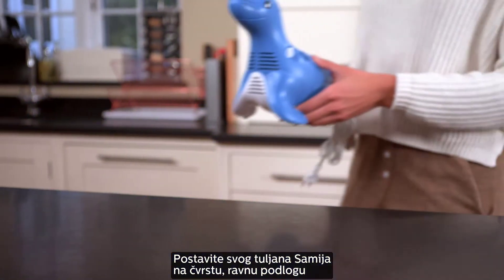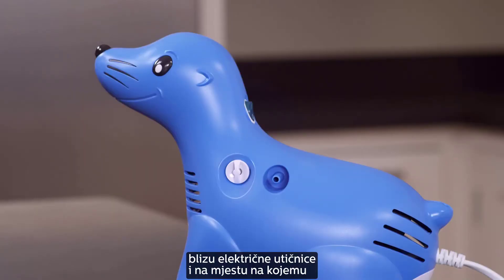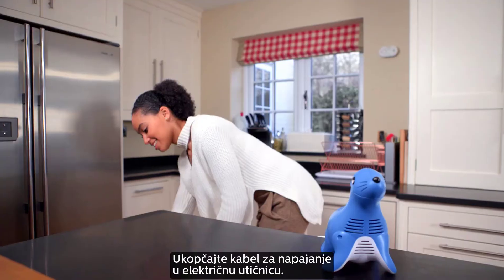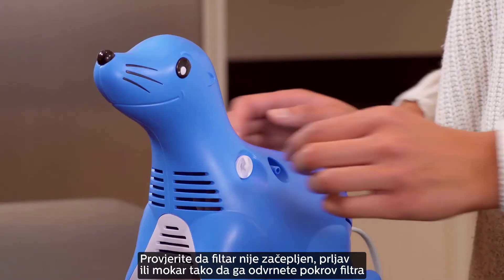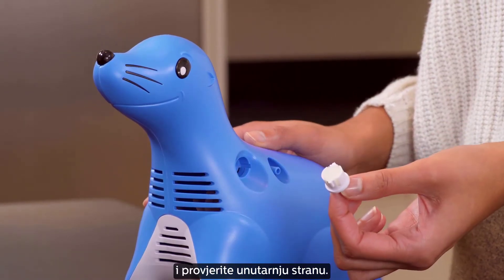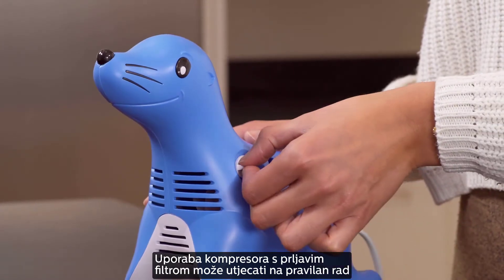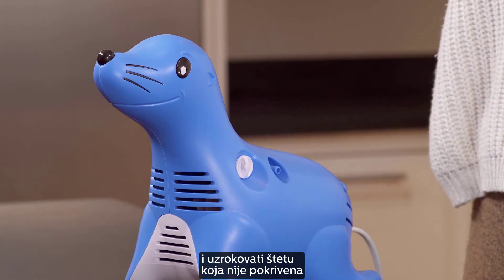Place your Sammy the Seal unit on a firm, flat surface near an electrical outlet and in an area where your child can be seated comfortably during their treatment. Plug the power cord into the electrical outlet. Check that the filter is not clogged, dirty, or wet by unscrewing the filter cover and inspecting the filter inside. Operating the unit with a dirty filter can impair proper operation and cause damage that is not covered by the warranty.